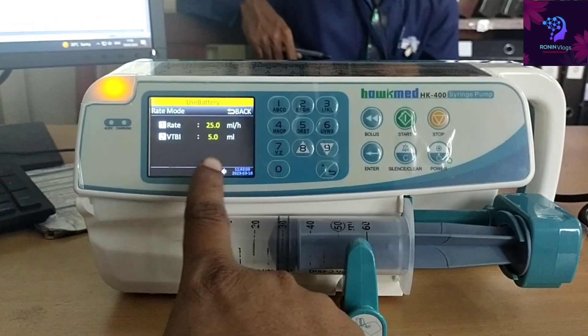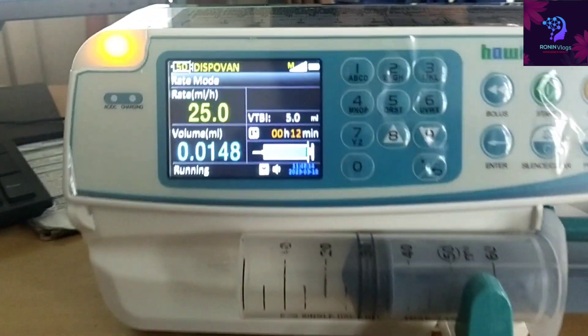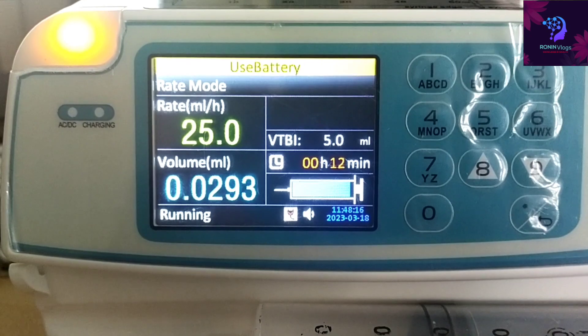Once started, the medication will go to the patient directly. If we need to stop, a stop button is also available — just press the stop button.